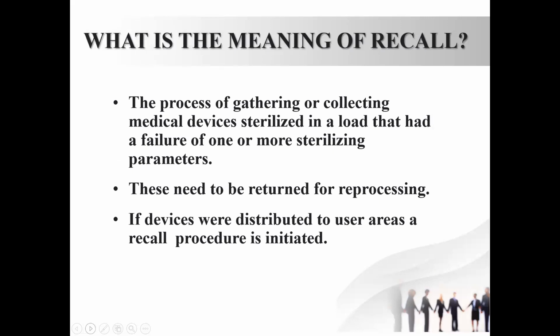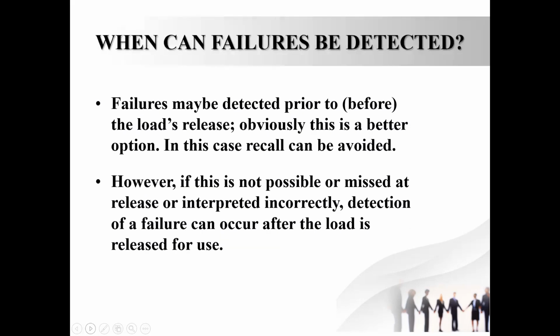What is the meaning of recall? It is simple. Re means again, call means back. So recall means calling back. The process of gathering or collecting medical devices which are sterilized in a load that had a failure of one or more of the parameters, that is a failed load, and the gathering is called a recall. They need to be returned for reprocessing. If devices have already been distributed to user areas, then a recall procedure has to be initiated or started.